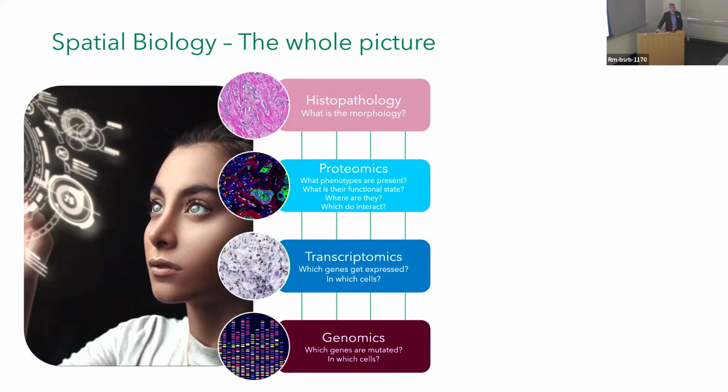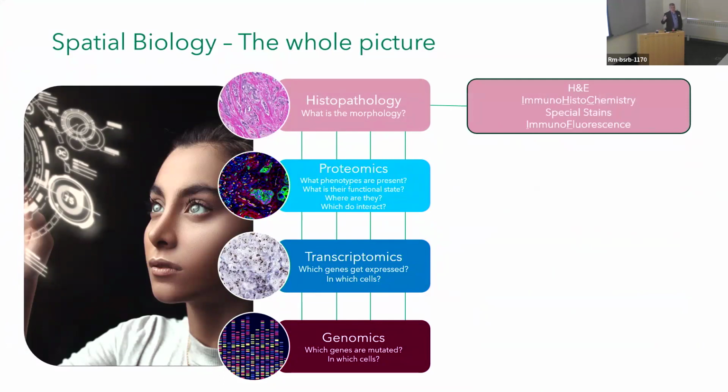For me, it always started with the H&E. H&E is the original spatial biology. It's really a morphometric approach. This is what our pathologists are using. They go to school for a long time to really understand what's going on in these tissues, and they're doing it through visual interpretation of the morphological relationships of all of the objects in that tissue.